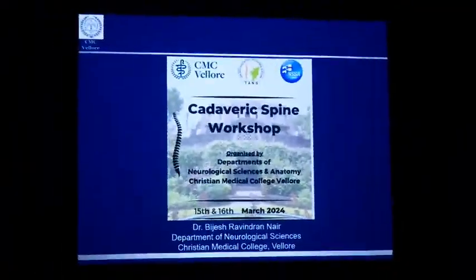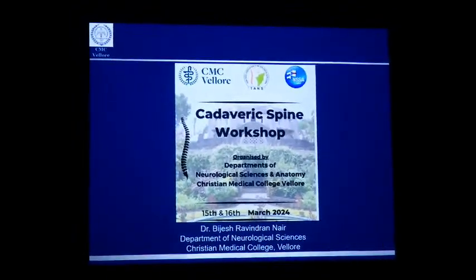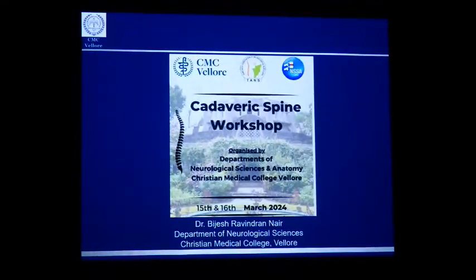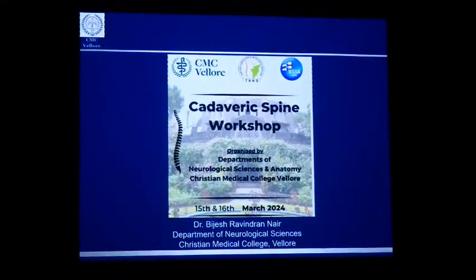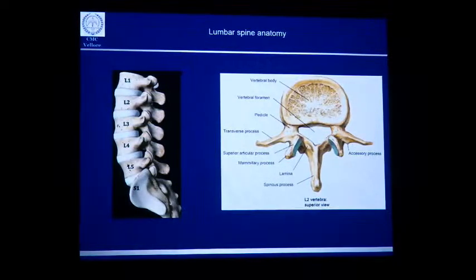fine. Good morning, everyone. We have finished cervical and thoracic, and let's go to lumbar and sacral anatomy. Here I'll be talking more about the principles of placing a lumbar pedicle screw, lumbar decompression, and principles of sacrectomy. So we have seen the basic anatomy of the spine, vertebral body, and all. Let me tell you how it is different.